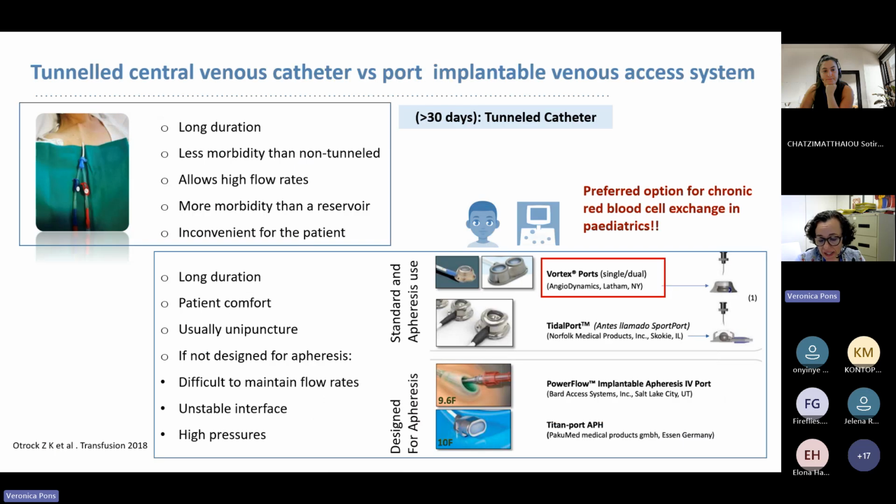And regarding indwelling catheters, as you all know, tunneled catheters are generally not useful in this context, and implantable devices, ports with a reservoir, are preferred. It's obvious because these are more comfortable for patients in the chronic setting.